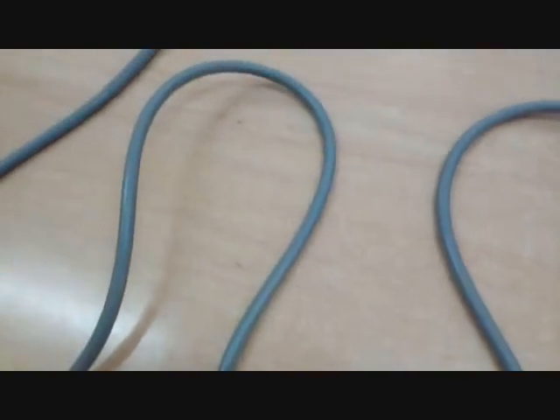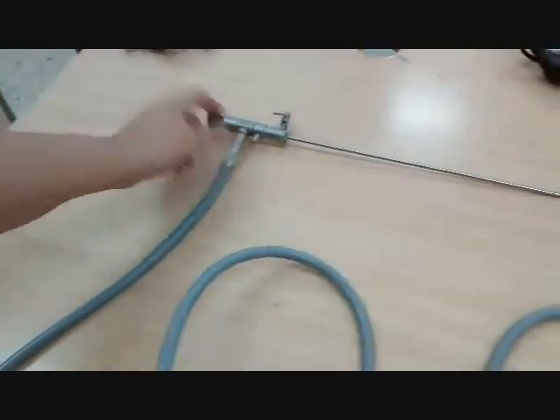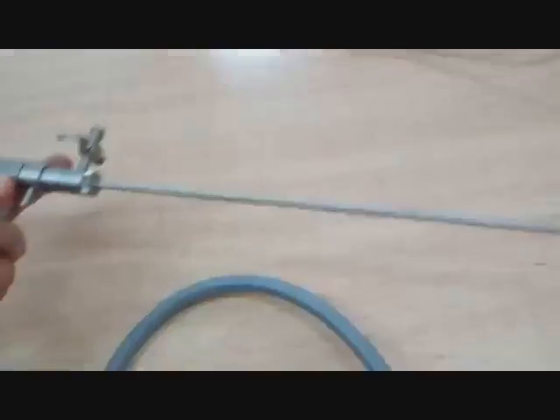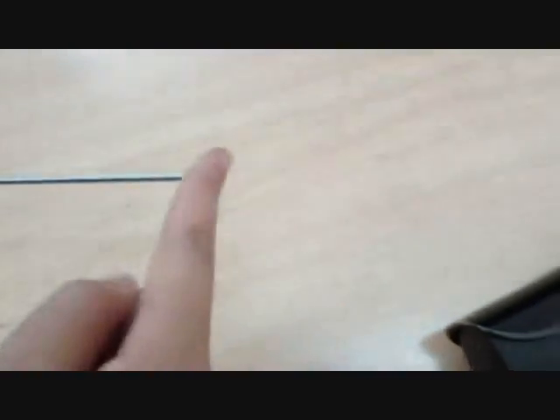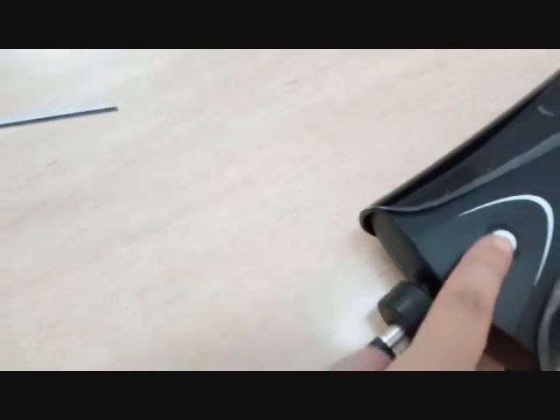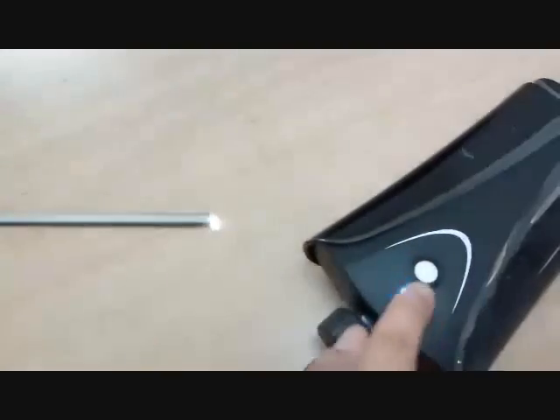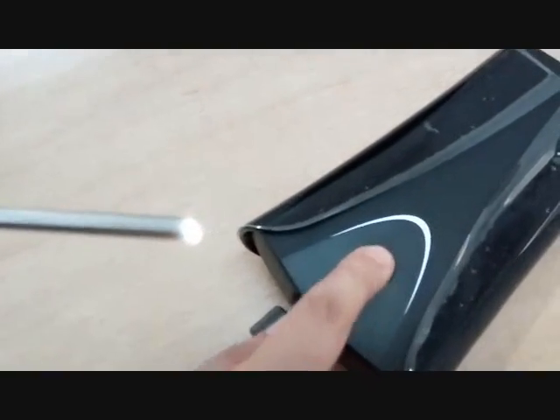Here's the light cable connected to the scope. And that's it. Here there is no light. We press the button. The light is on. We press it again. The light is off.